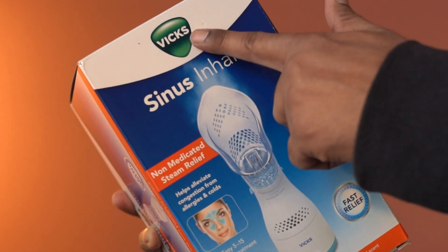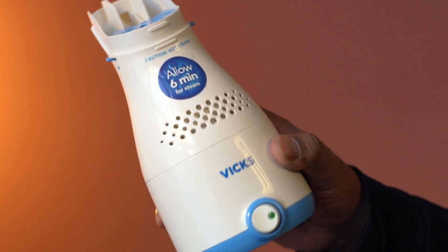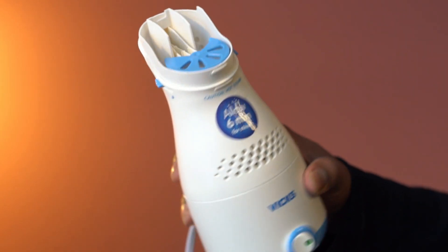This is a pack of steam inhaler from VIX. The material here is plastic, and it looks to be very well constructed.